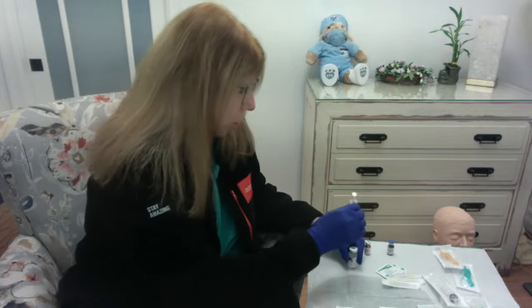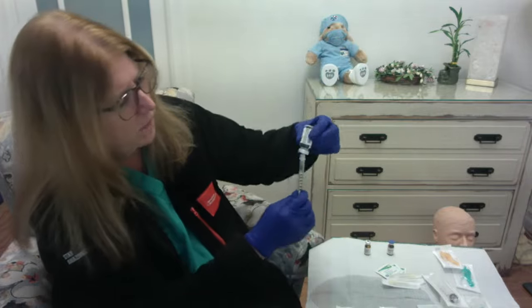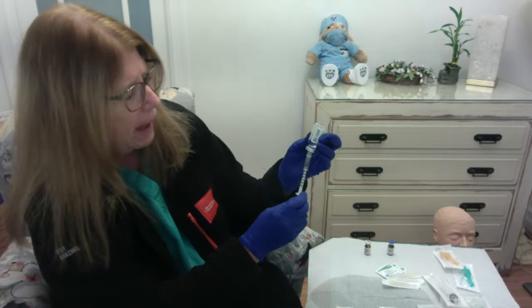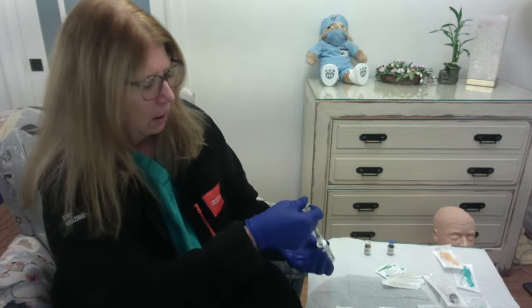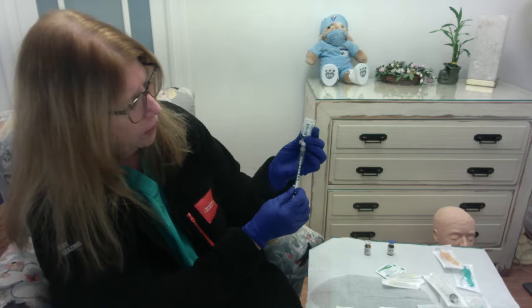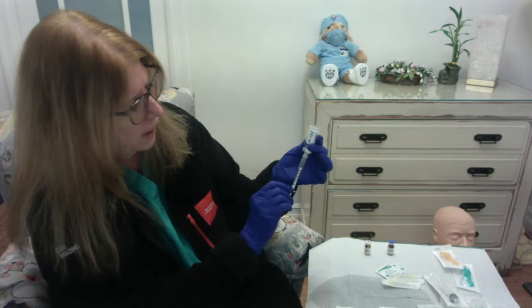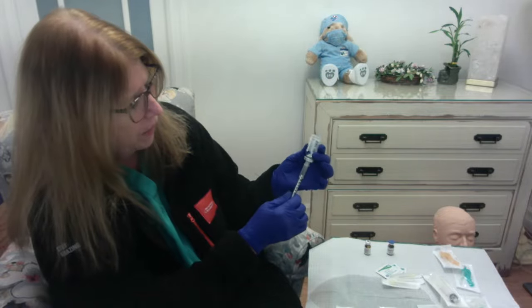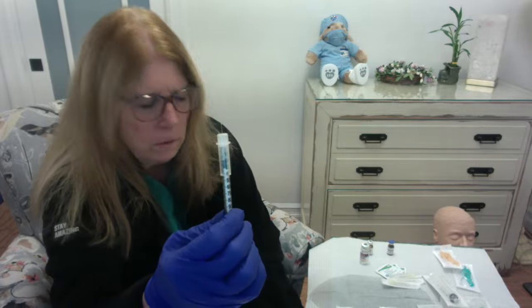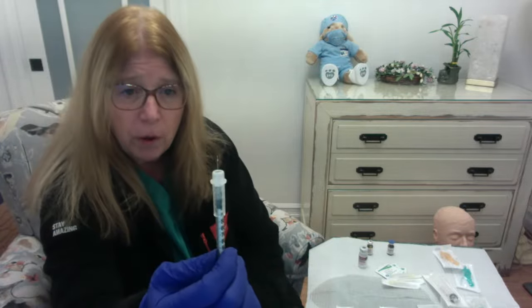And again, I'm going to hold this vial down. I'm going to put that needle in. I'm going to do an invert. I'm going to have that window facing me, right? The window facing me. And I am going to inject the air. And then I'm going to invert. And then I'm going to start pulling back. And I'm going to stop when I get to my 20 mark, which is right about there. Okay? So 20 units of this Humalog Lispro insulin, 20 units drawn up in the syringe.